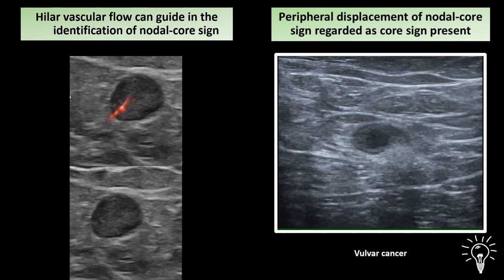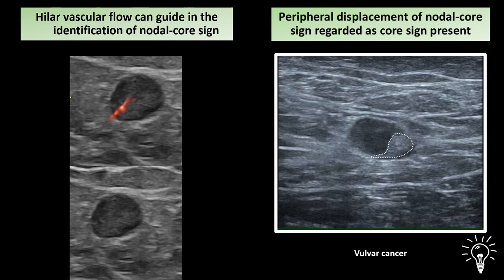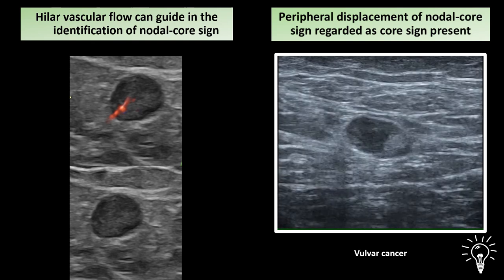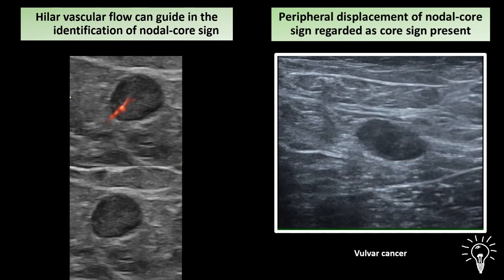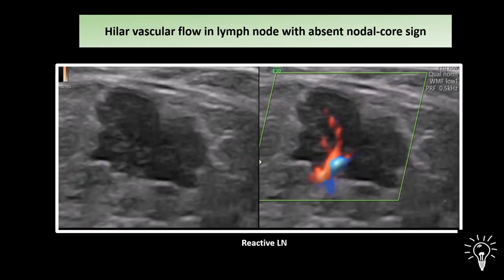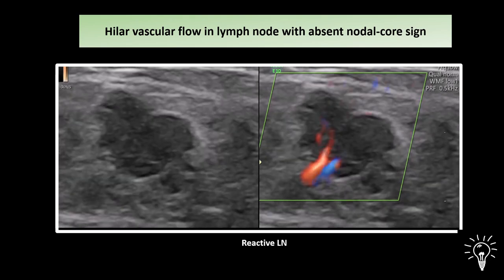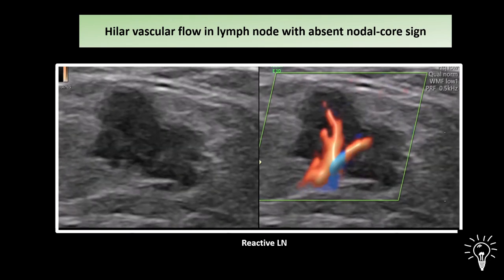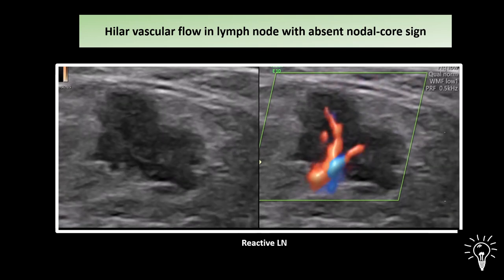Please note that peripheral displacement of the nodal core sign is still regarded as the nodal core sign being present. The medulla may be displaced to the periphery due to large intranodal metastatic lesions from vulvar cancer. Even when the hyperechogenic nodal core sign is absent, hilar vascular flow may be detected, as seen in this reactive lymph node.